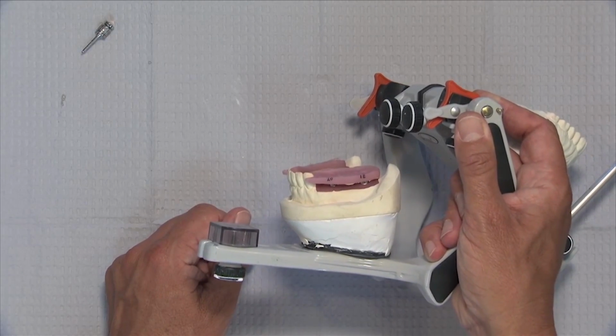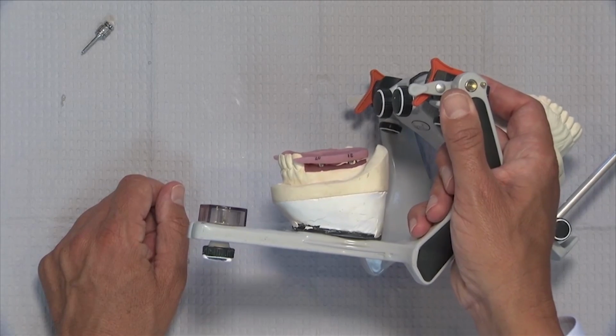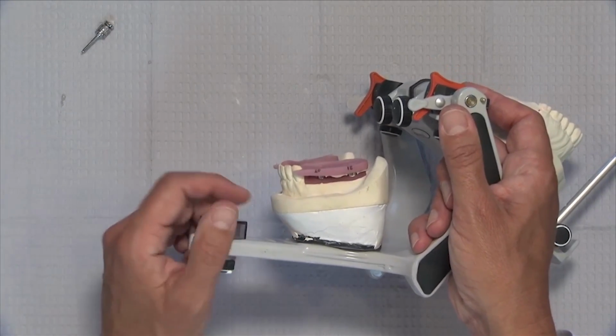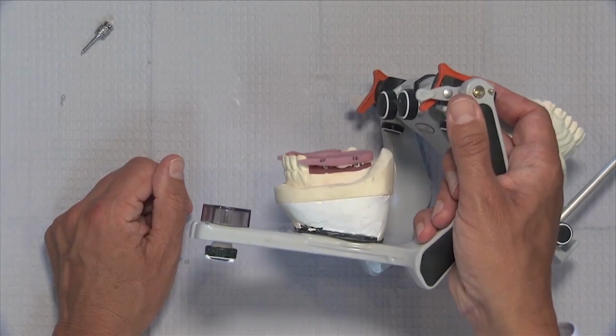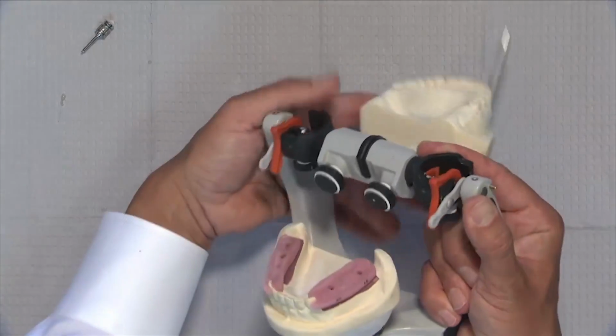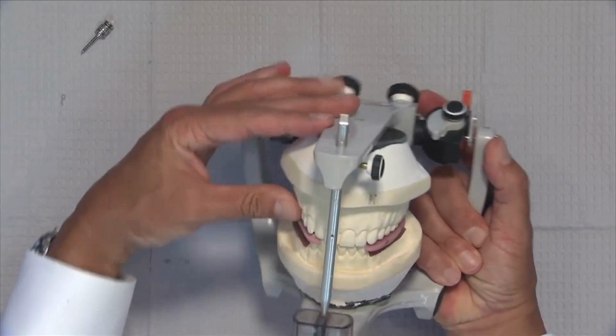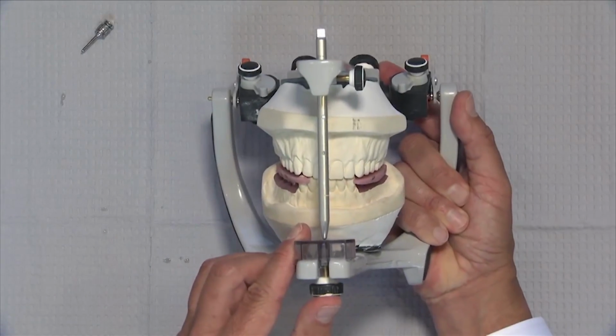And if you do, that's fine. And you're going to save yourself a lot of time at the seat appointment in adjustments if you do this type of bite registration. I just find it to be easier to do it in conjunction with the custom abutments and be able to get this bite. So let's go ahead, now that we've got this free and the patient can close down all the way without any interference and we've got our stable platform, let's go ahead and do our bite registration.